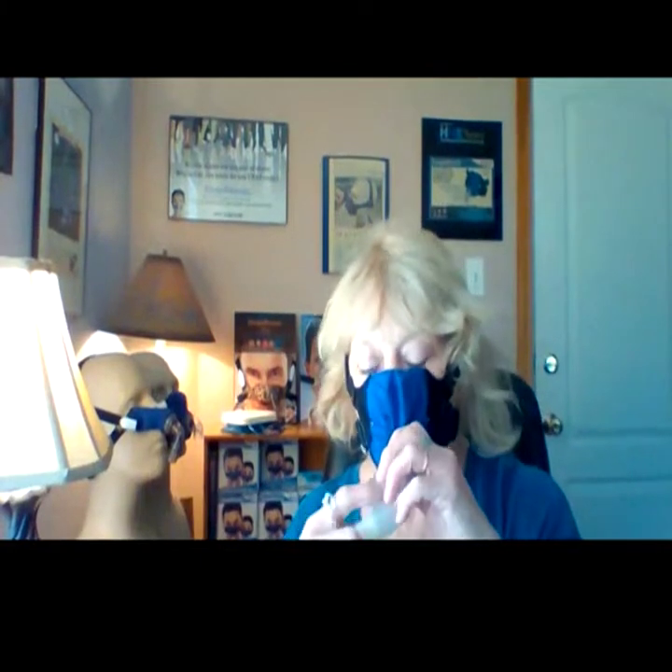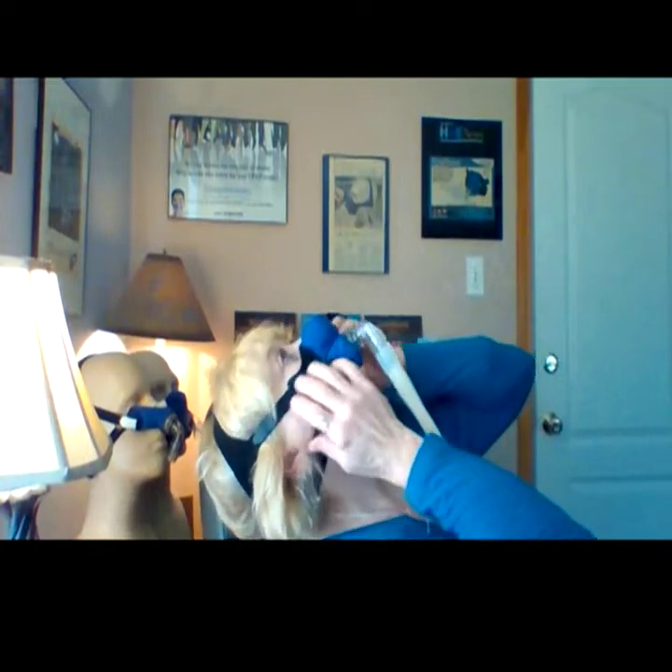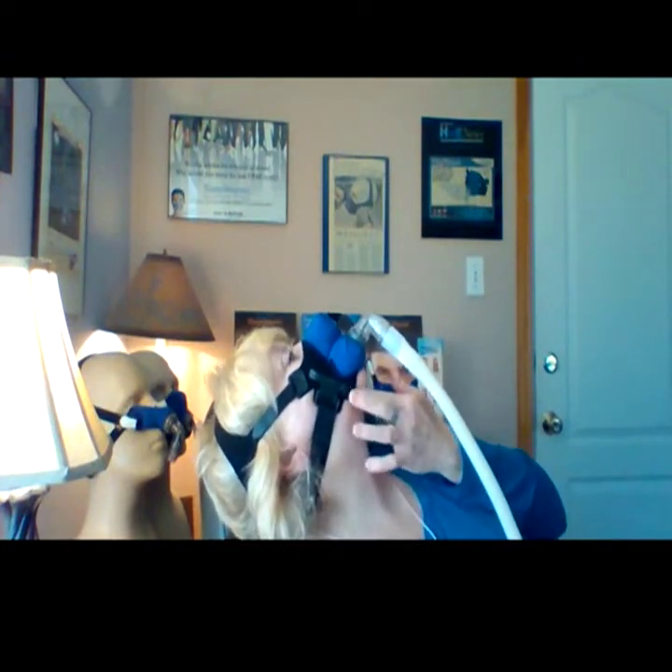Let me show you. I'll fit my nose — make sure it's in there, not above my eyes. My lips are in that opening. I'll lay back. Once your mask is on, you just shimmy it.